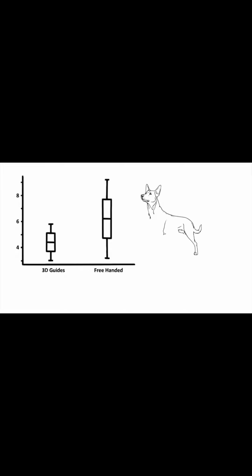The study found that overall, the mean angle deviation for all osteotomies performed with three-dimensional patient-specific guides was 2.8 degrees plus or minus 2.8 degrees, which was less than the mean deviation for the freehand osteotomies, which was 6.4 degrees plus or minus 6.0 degrees. This suggests the guides generally improved accuracy.